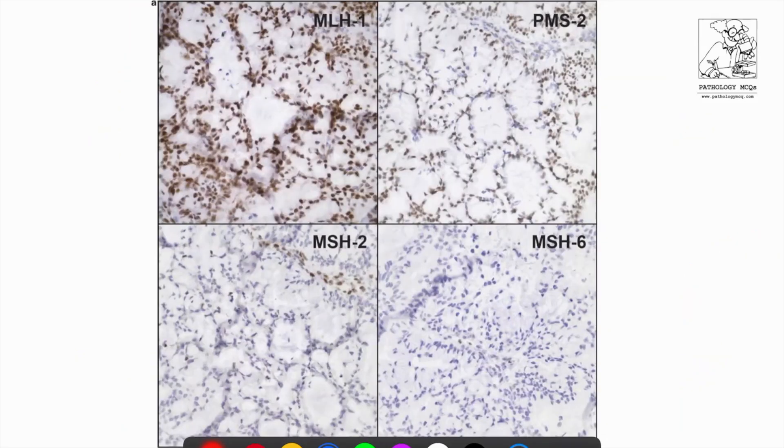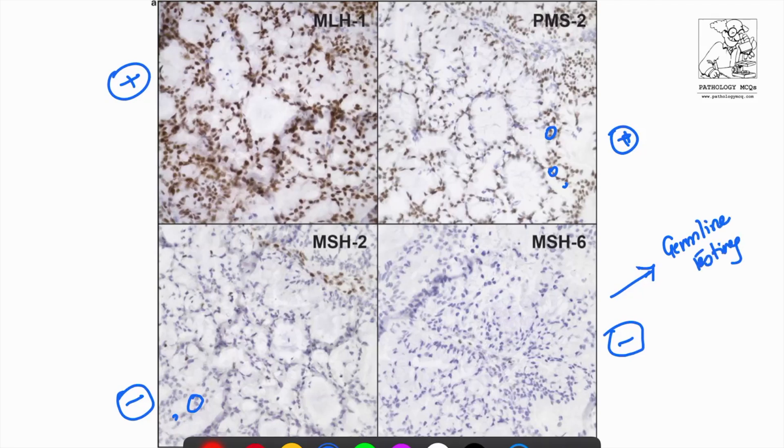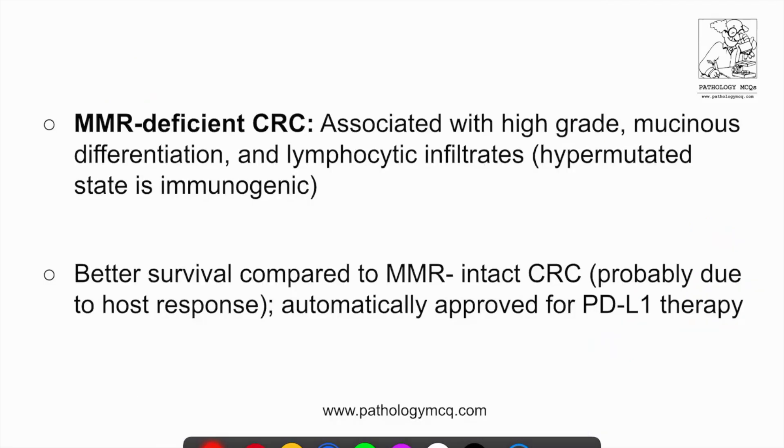There's another case here where you can see MLH1 is intact. PMS2 is also intact. You can see this in the tumor cells. MSH2, however, is lost. MSH2 is lost and MSH6 is lost. So what should be done in such cases? In such cases, what should be done next is germline testing for MMR. Germline testing for the MMR proteins, particularly MSH2 and MSH6 to see if they are lost. PCR is a good method to test.